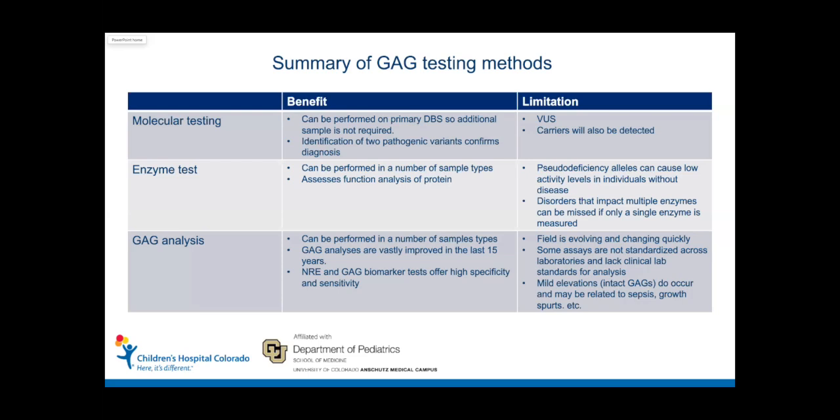And so we need a way to deal with those. That's either the expression work that Dr. Steet does and others do, or it's a corresponding GAG analysis. And it's the mixing of all of these that we're hoping to put back together to make the diagnosis of MPS in a patient.